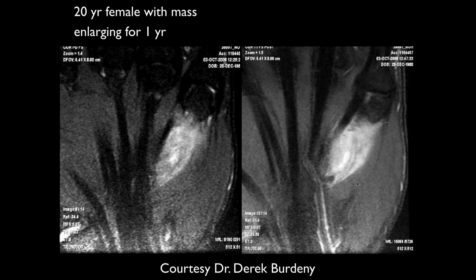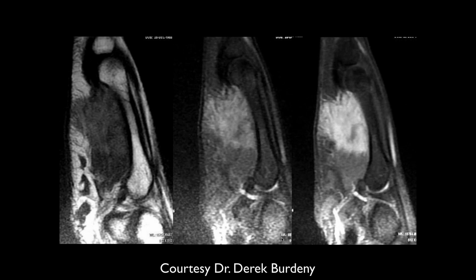Okay. So it looks like a hyperintense lesion along the hypothenar aspect of the hand, but kind of encircles the fifth flexor tendon, maybe. I mean, it doesn't have a well-defined margin. You could maybe draw it, but actually, I will take it back. Maybe a well-defined mass. Again, I guess it is in the fibrous category.